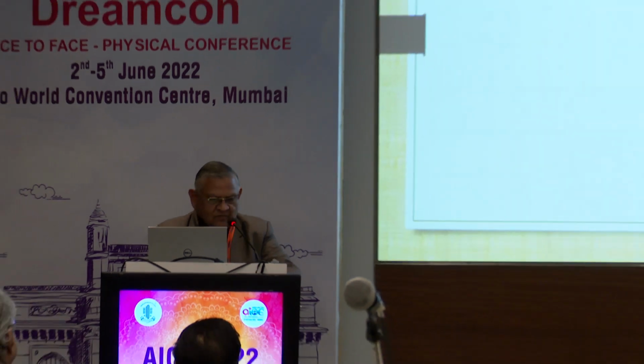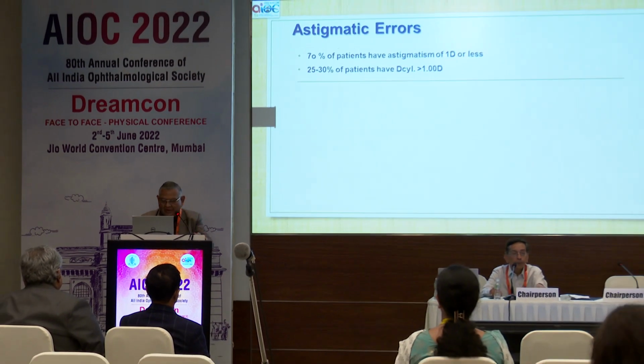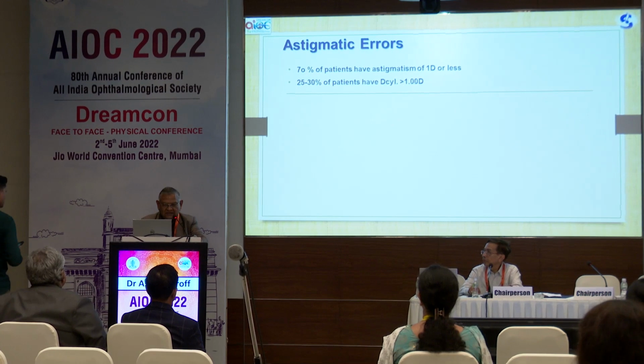Because in cataract surgery, the expectations of patients have increased a lot because of the advancement in lens quality, premium lenses, and so on. We need to not only do phaco, but the patient is concerned with the vision, and that is more important for the patient. Now, my assigned topic is how to tackle the astigmatic part.